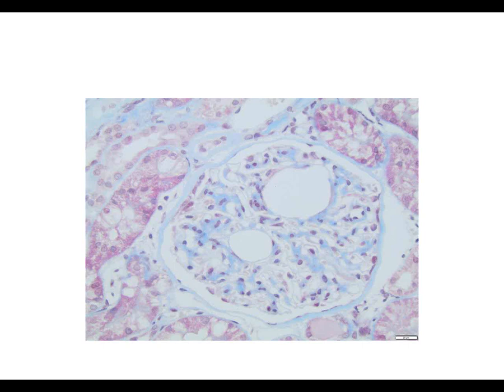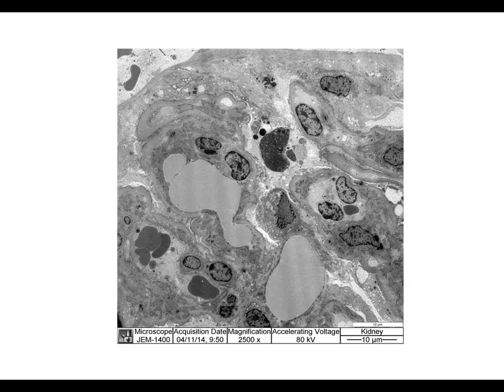I call them lipid emboli on the diagnosis. And I think the next one is the EM. And so do you see that kind of homogeneous, amorphous, semi-osmophilic material? This particular lipid embolus lesion looks somewhat similar to, now I'm forgetting the name, lipoprotein glomerulopathy in humans, which is a genetic disease in humans. So our lesions are similar, although the EM appearance in our dogs is a little bit different. In humans, it's a little denser, a little more electron dense than what we're seeing here in this particular image. Hopefully we'll have more information about this disease in the future.